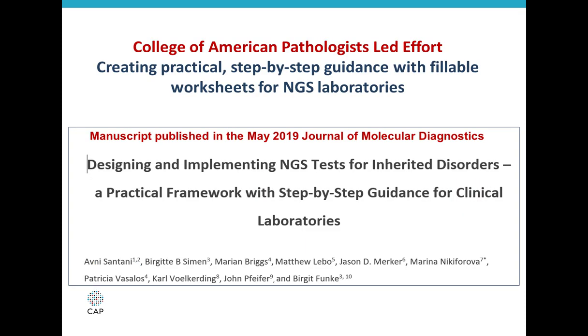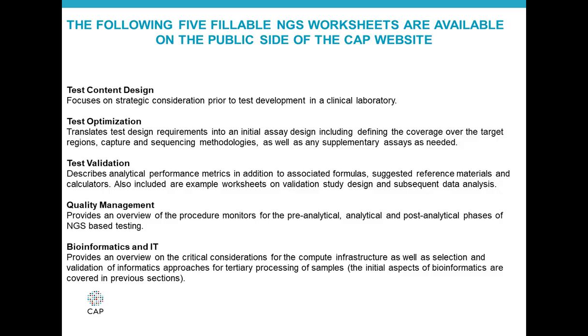Another good recent manuscript from Dr. Avni Santani and her colleagues was published in the May 2019 issue of the Journal of Molecular Diagnostics, as noted here on the slide. And this manuscript contains many practical step-by-step guidance instructions for next-generation sequencing-based testing validations.